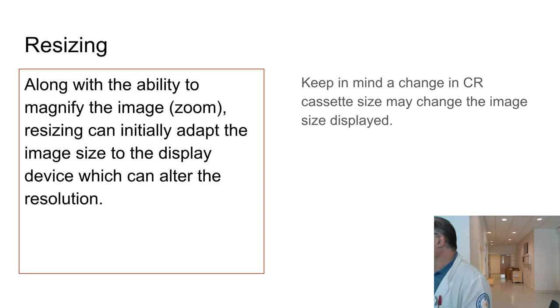DR. So recognize, though, in DR you still collimate. So DR is different than CR, right? The image size will change, which is why you should collimate down to the size of the hand. Because if you leave it open, so we can do that here because we have a DR room. That's another lab within the lab. We can do the same hand, one with the collimation open all the way, one with it closed. But if you don't, the magnification will change, in addition to radiation exposure, right? That's a separate topic, but of course it's related.